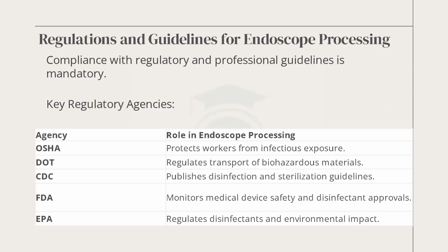These agencies also make contributions to endoscope care. OSHA protects workers from infectious disease or exposure. OSHA is on the side of the workers. They make sure that the hospital supplies you PPE so that you don't infect yourself and take it home. Then the Department of Transportation, DOT, regulates transportation of biohazard materials. CDC publishes infection and sterilization guidelines. So the CDC collects data and publishes guidelines.